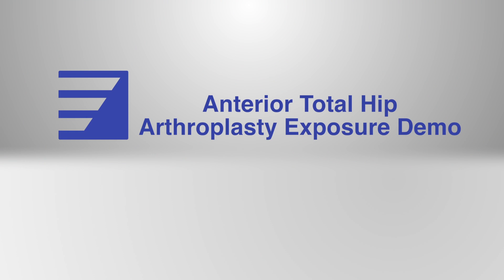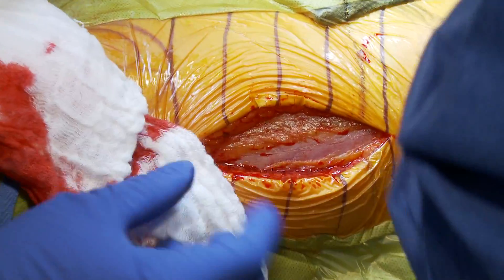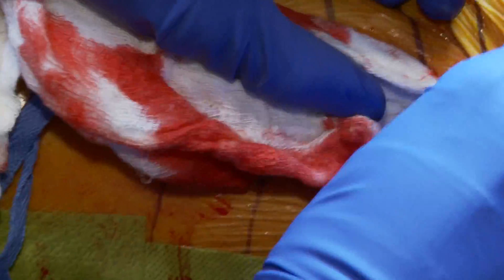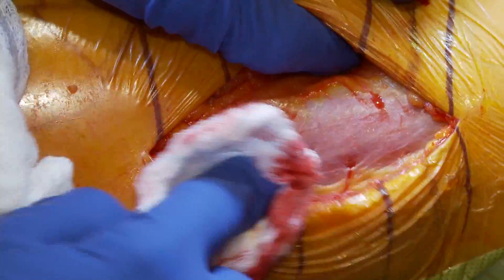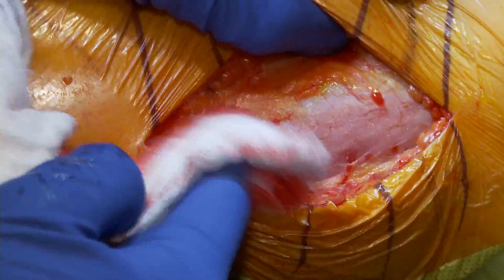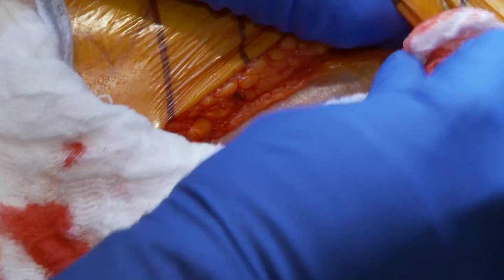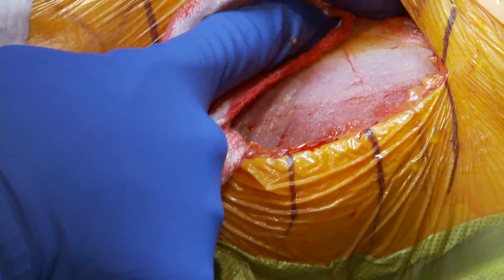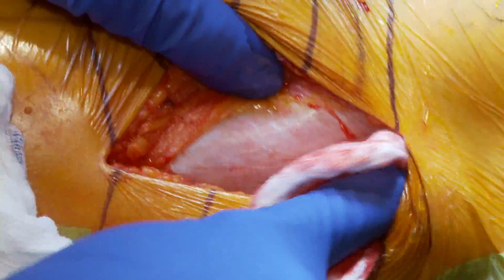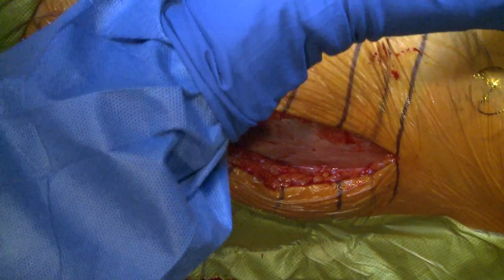You can see this bluish fascia — it's very thin and translucent, which tells me I'm in the right muscular plane. If I were to see thicker, whiter bands of fascia, that would mean I'm too medial, towards the sartorius. So this bluish, translucent fascia is what I'm looking for.